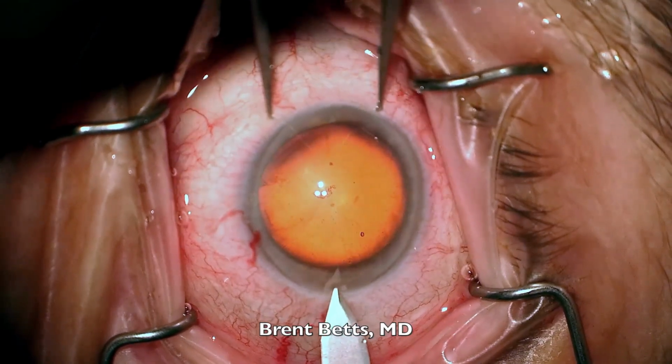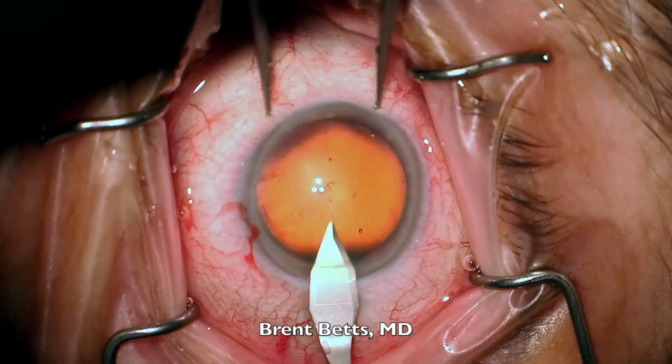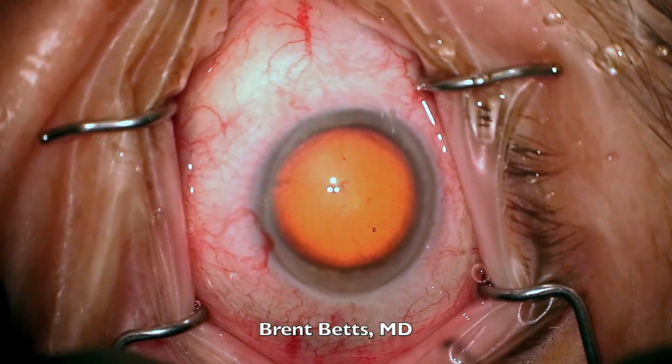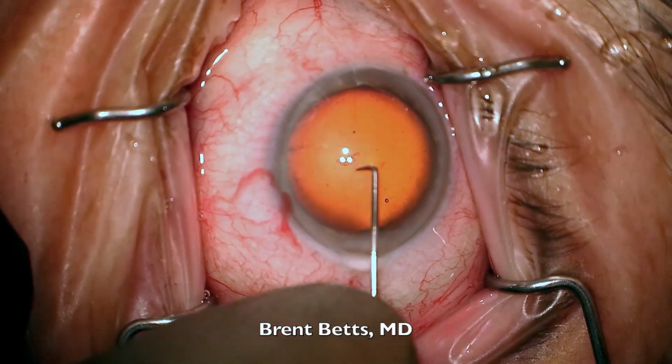I'm making a small partial thickness incision in the cornea called a Wong pocket and making the main incision. It's what we call a triplanar incision, using 3 small movements to help with the incision that can close on its own. The incision width is 2.5 millimeters.